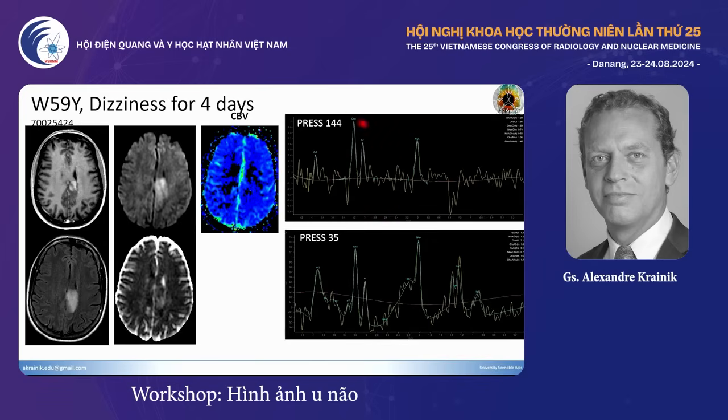Okay, we see some choline here, but not extremely high. Here it's the same, but choline is always higher than creatine, more than 1.3. Then there is some choline, NAA, well, a slight drop. Obviously, we have lactate, and at short TE, we also have lipids. Taken all together, it shows a real tumoral profile. Here, it's also in favor of a tumor, and the perfusion is compatible with a lymphoma.